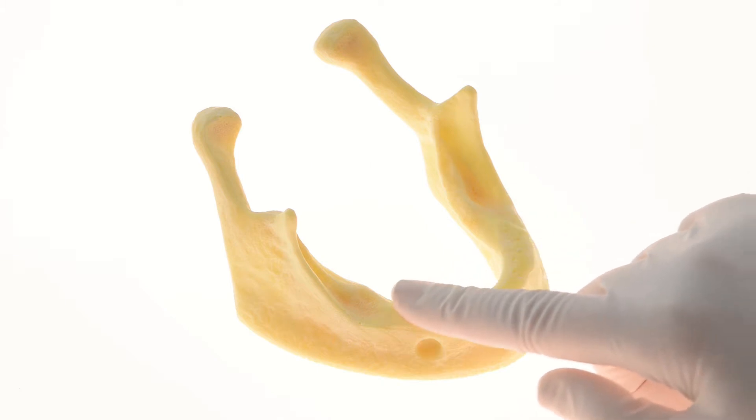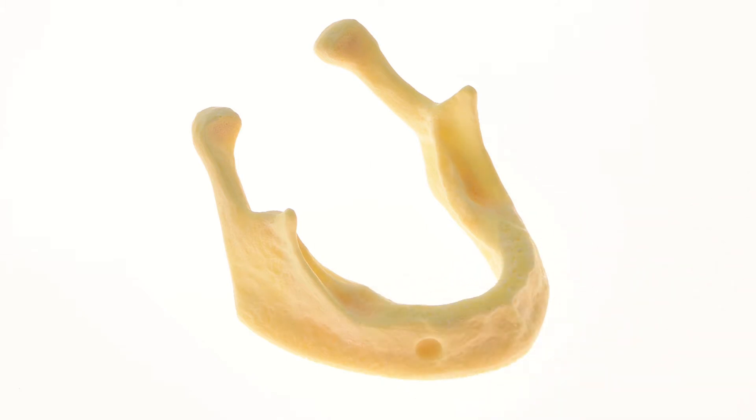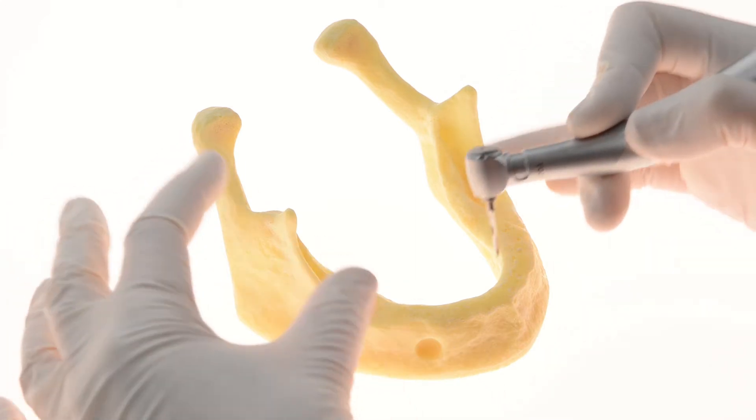Before working with Multifix, flatten the ridge in order to achieve a wider base for the restoration and ensure lip support.